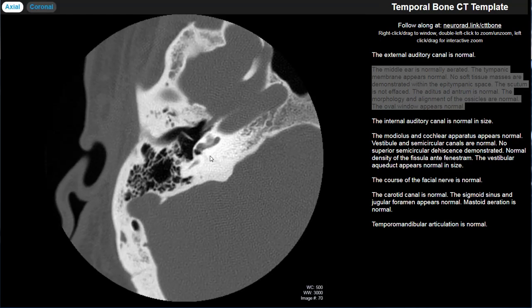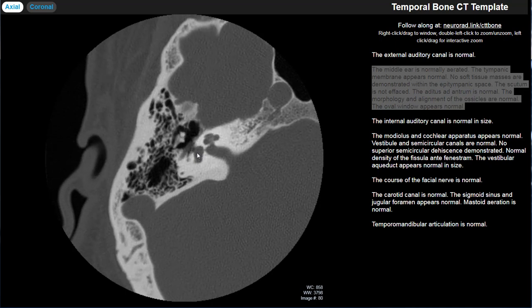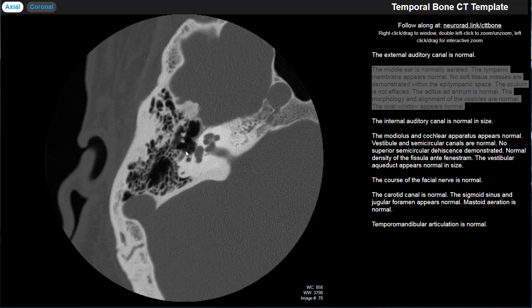Switching to the axial view to discuss the middle ear further. I talk about middle ear aeration and the tympanic membrane first, then soft tissue masses in the epitympanic space — essentially looking for cholesteatomas and discussing whether the scutum is effaced. The best shot of the ossicles on the axial image looks like an ice cream cone: the ice cream is the head of the malleus and the cone is the body and short process of the incus.